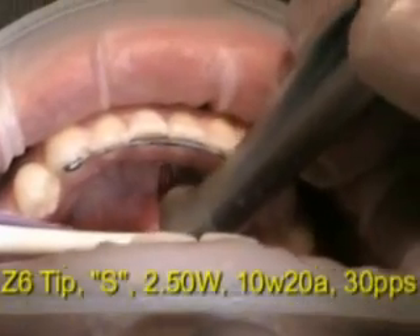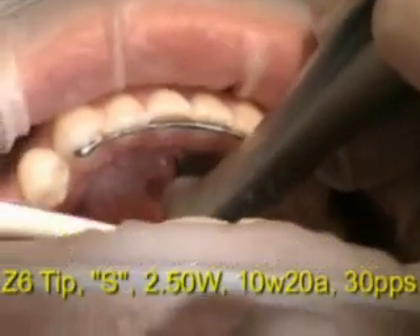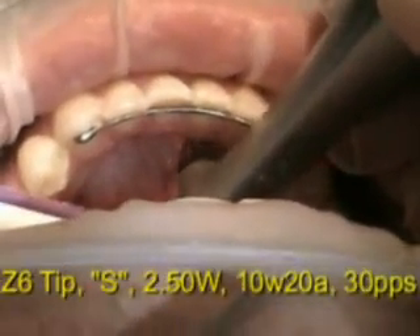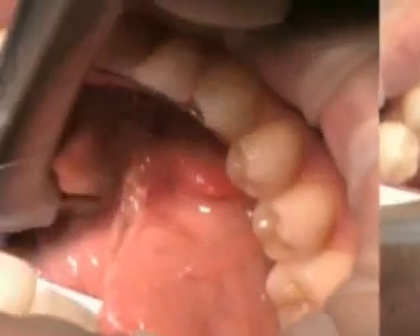Here you can see this band — it looks like a rubber band — and it's actually fiber connective tissue. I've used topical anesthetic, and we're just identifying this. You can see his goes very high into the tip of the tongue.